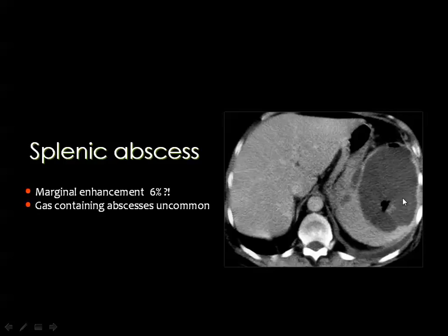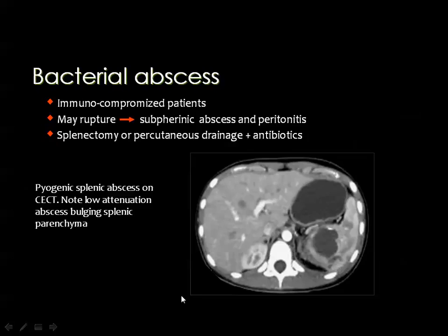any of the clinicians who would like to have some samples from this fluid for culture, or even for just analysis. But if you put a needle, you expect to introduce some air. But if you see air without any history of introduction of any needles, then you are almost sure that this is an abscess.